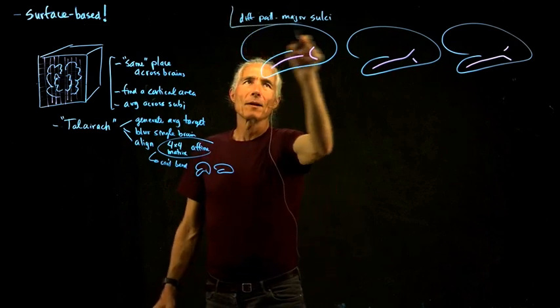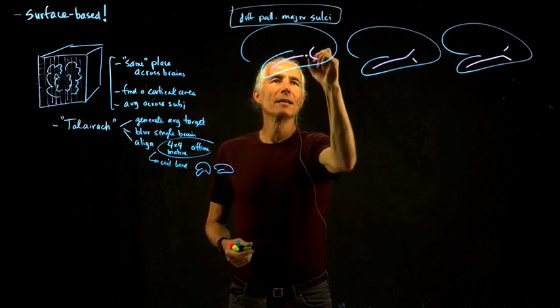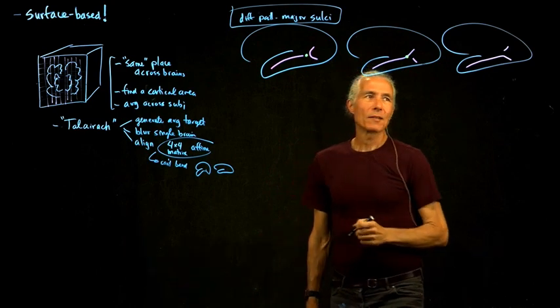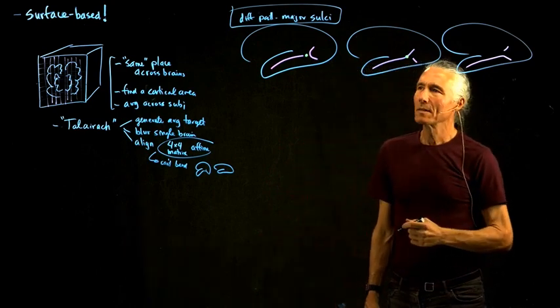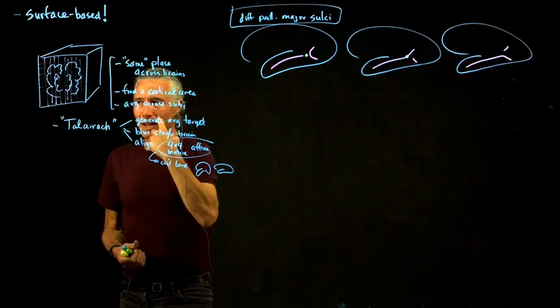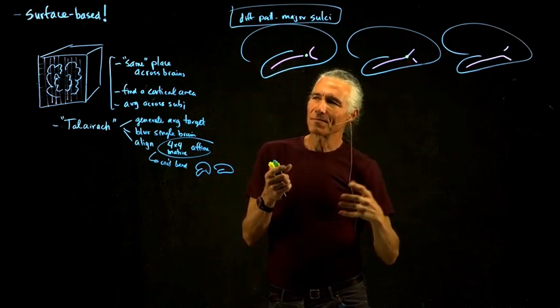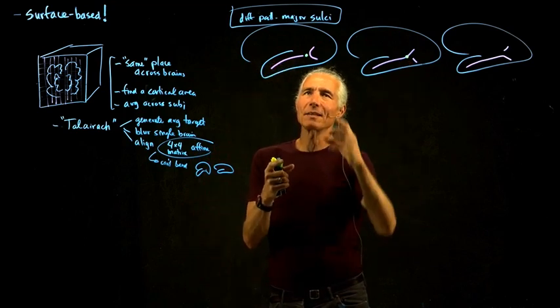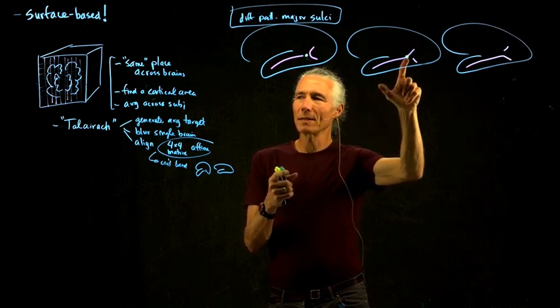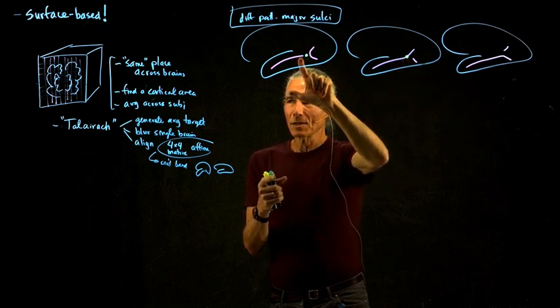So that's a problem. And what is the problem? Well, if you happen to be at this point in the brain, that point in the brain might actually be in a sulcus in the other person. So when you try to use a 3D method, if you were doing it perfectly, you would expect that a point here that's on the gyrus ought to actually correlate with a point that's in the sulcus. But then if you just go a little behind, you have a sulcus correlating with a sulcus.